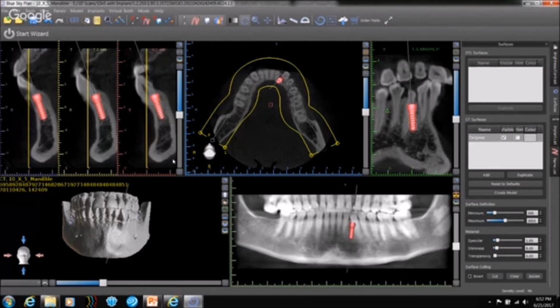There are a few times when I've got questions like, hey, what do you think about this number? And it's a CBCT image, and I say I don't have an opinion. You shouldn't be looking at it, because that could give you a false positive. That's a limitation of the science by itself. It's not a limitation of the type of unit that you use or the manufacturer of the unit. It's just a limitation of the physics when it comes to CBCT.